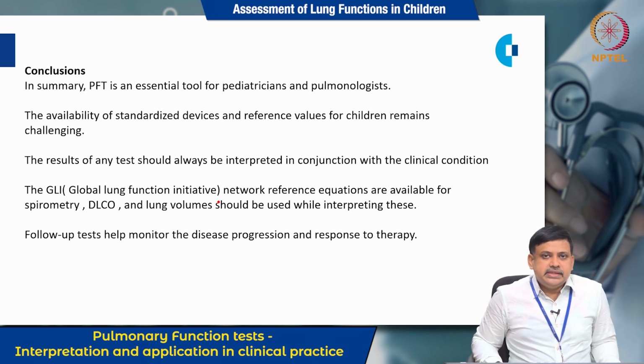In conclusion, in summary, the PFT, pulmonary function test, is an essential tool for the pediatrician and pulmonologist. The availability of standardized devices and reference values for children remains challenging. The results of any test should be interpreted in conjunction with the clinical condition. This is most important.